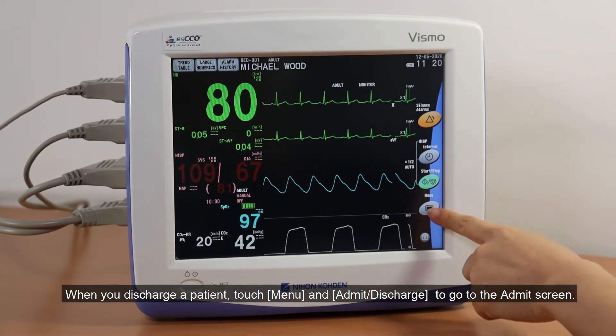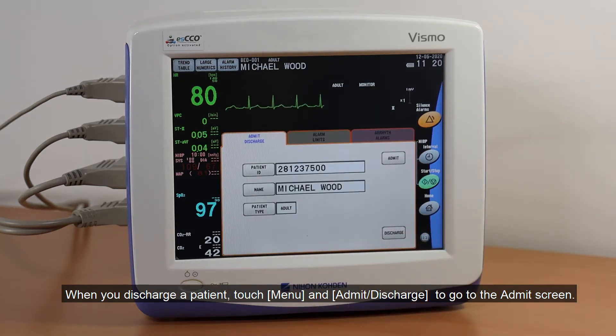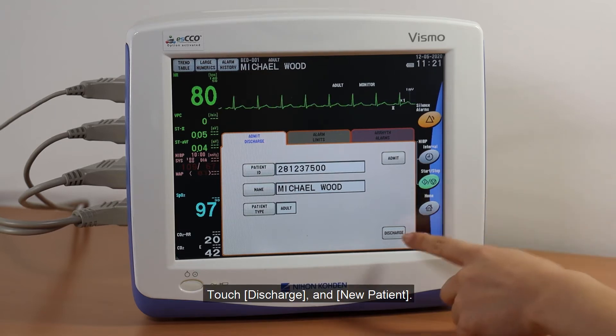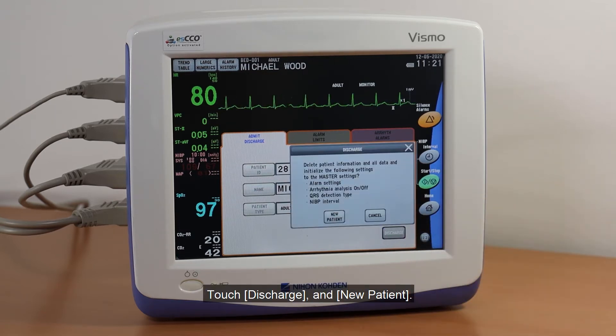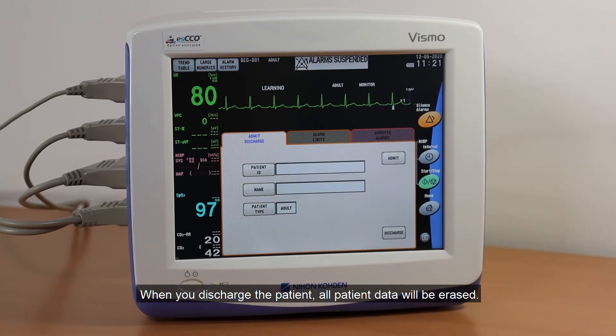When you discharge a patient, touch Menu and Admit Discharge to go to the Admit screen. Touch Discharge and New Patient. When you discharge the patient, all patient data will be erased.